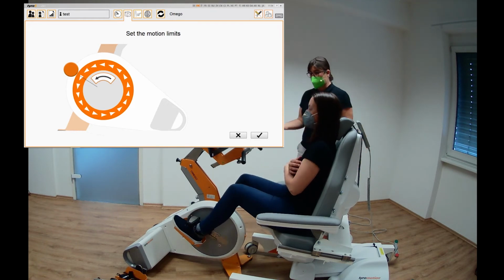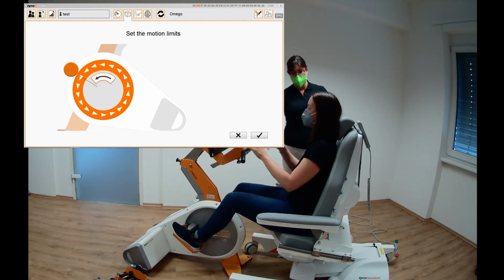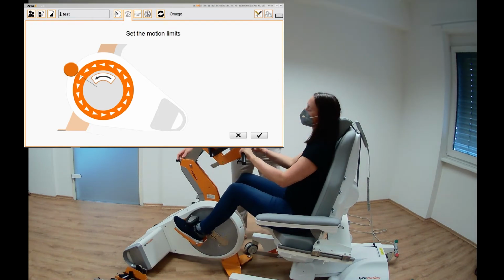You can use the handrails. Oh, thank you. Today I'm a nice therapist.